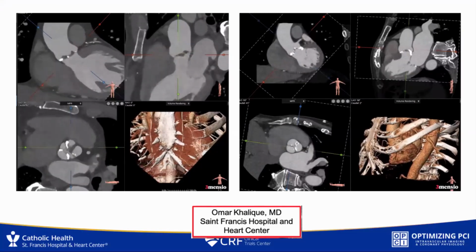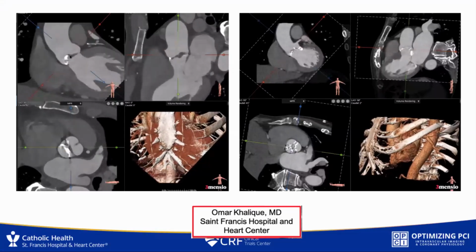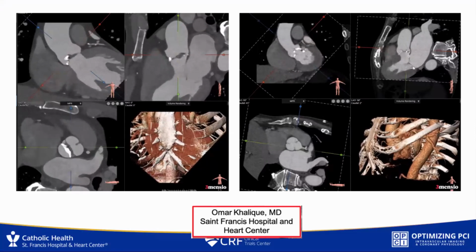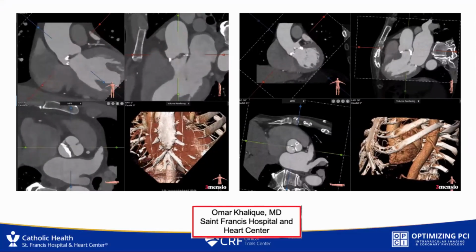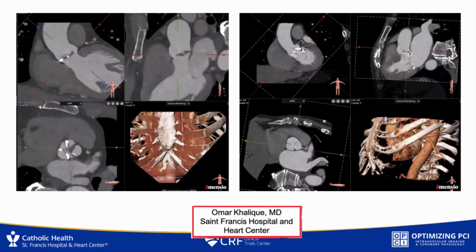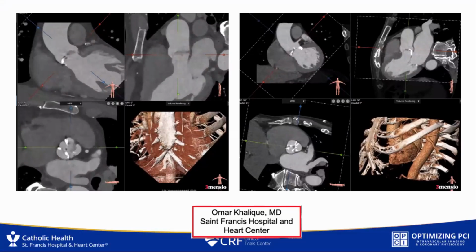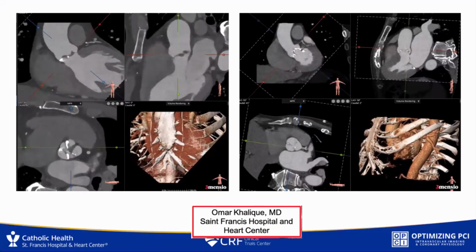But you can see on the left, from the photon counting CT with Siemens, it's a dual source, so the temporal resolution is better in general. So you can see it's a much smoother image. And then also we have a much higher degree of resolution and image quality, even compared to a different scan, which is also done on a high-end scanner.